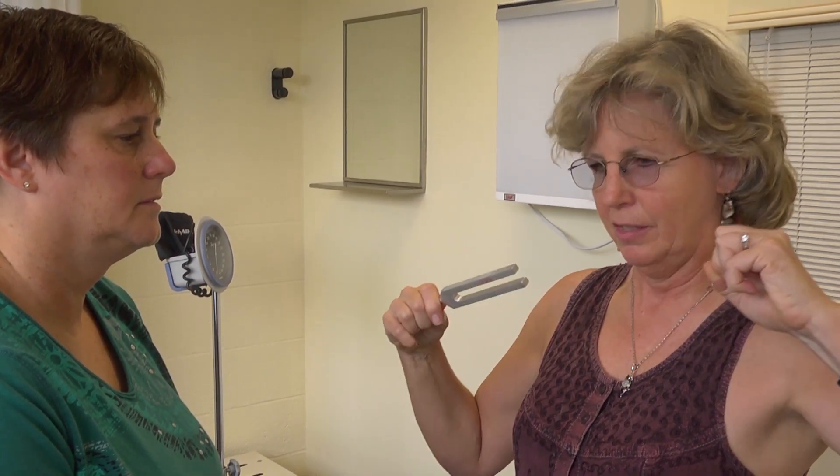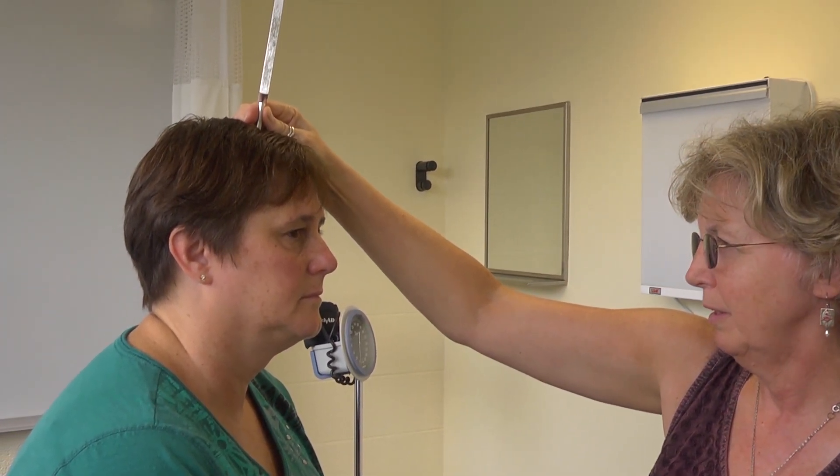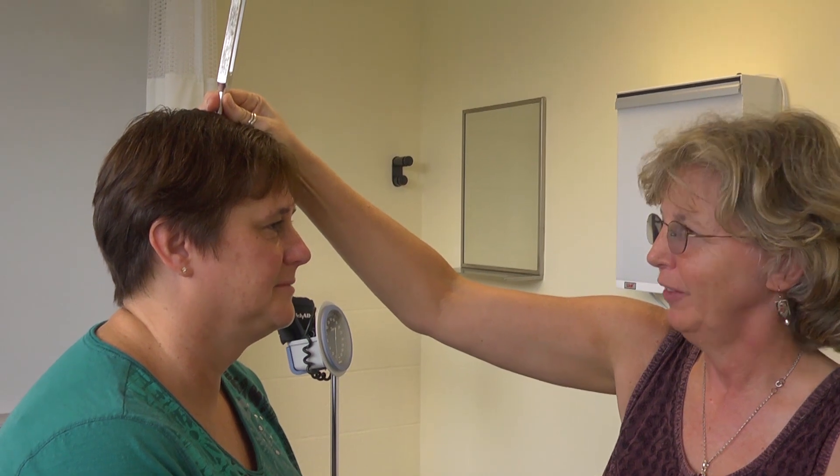If there's any question about hearing ability, there are two additional tests: the Weber and the Rinne. Use the 512 Hz tuning fork. Strike it and place it in the middle of the patient's head — that's the Weber test. A normal exam would localize in the middle. In this case it lateralizes to the left. Strike the fork firmly to get a good sound on both sides.